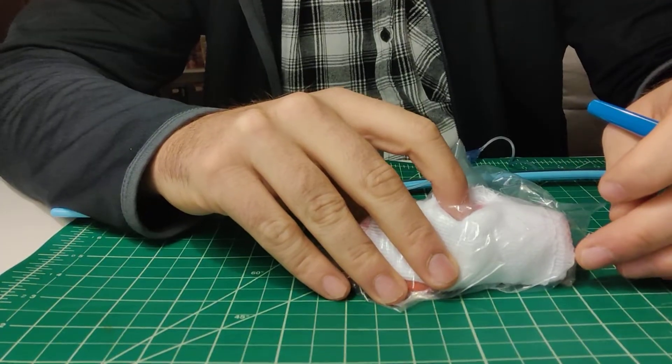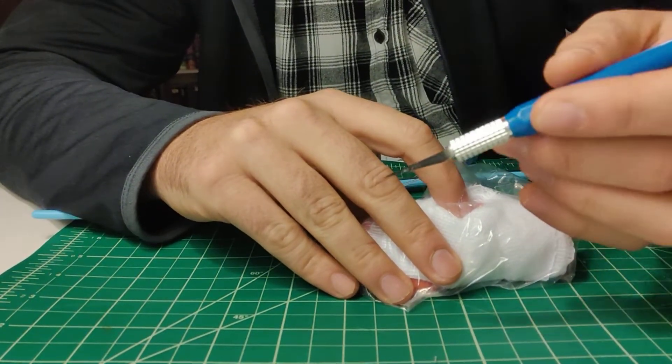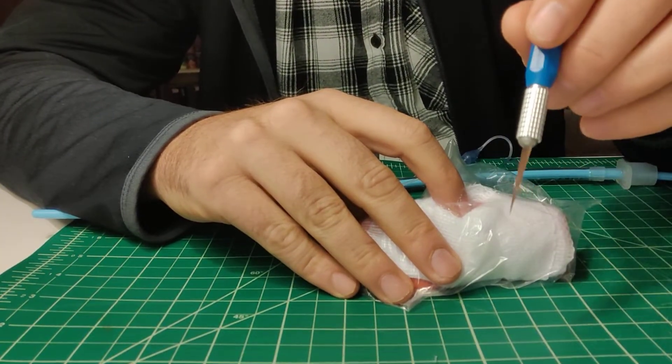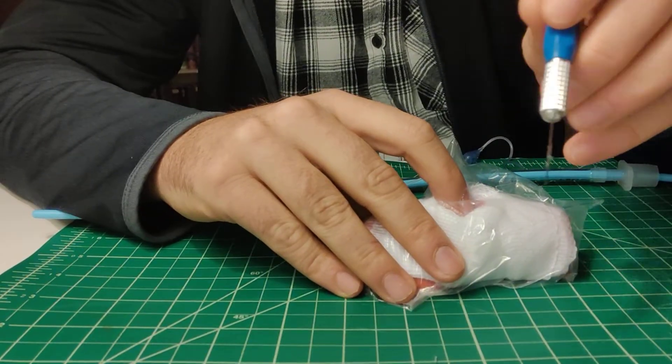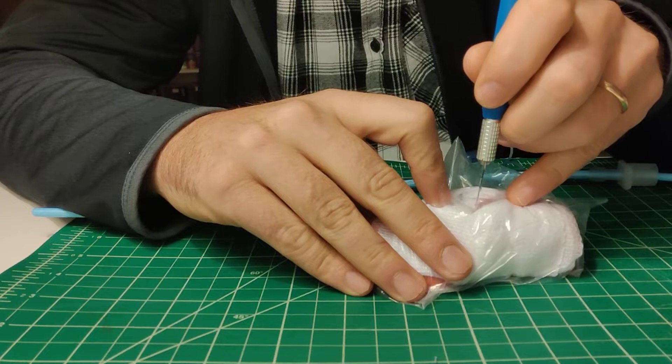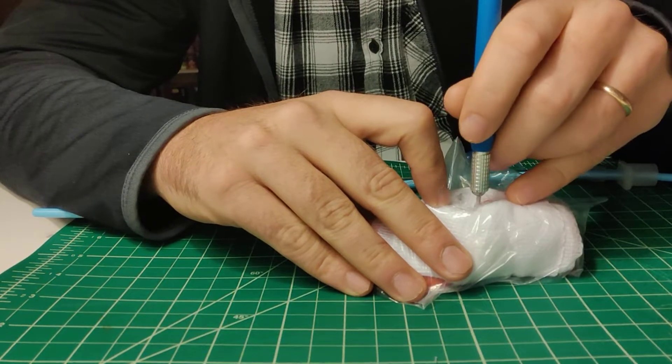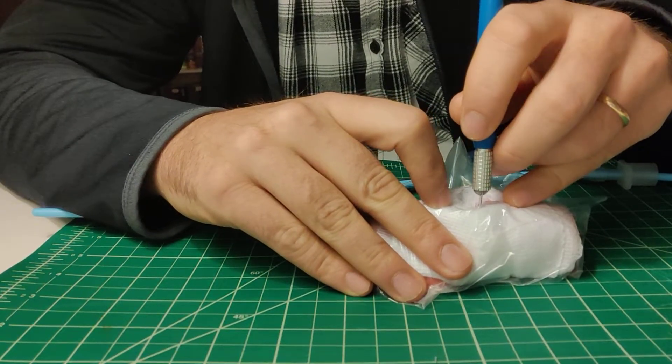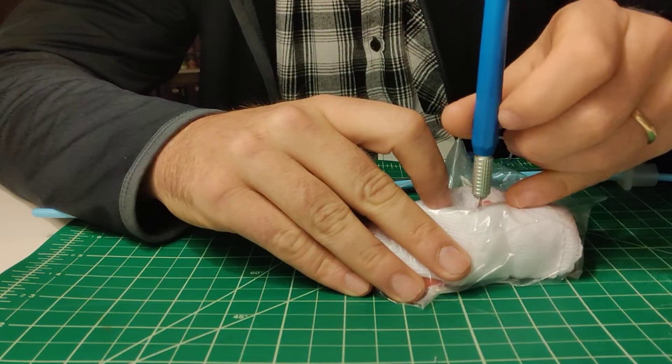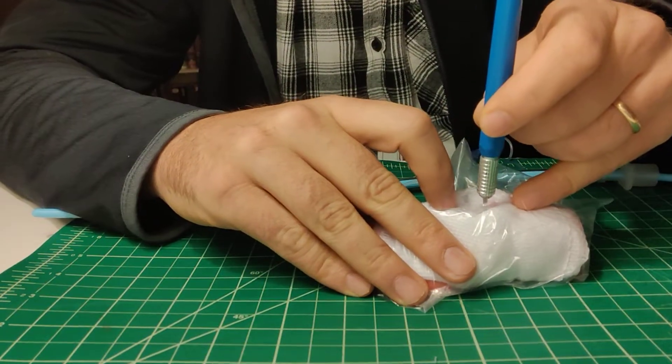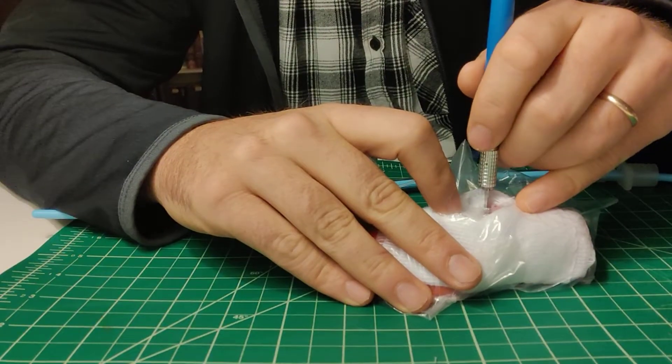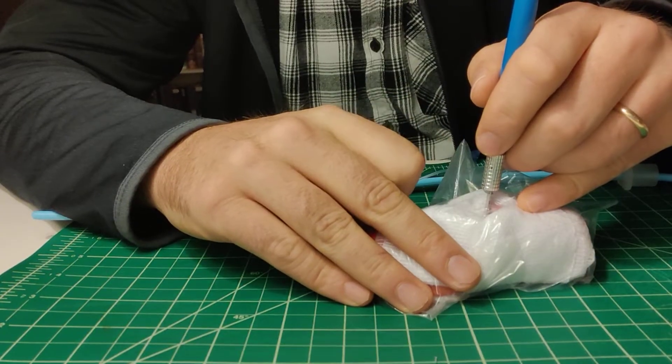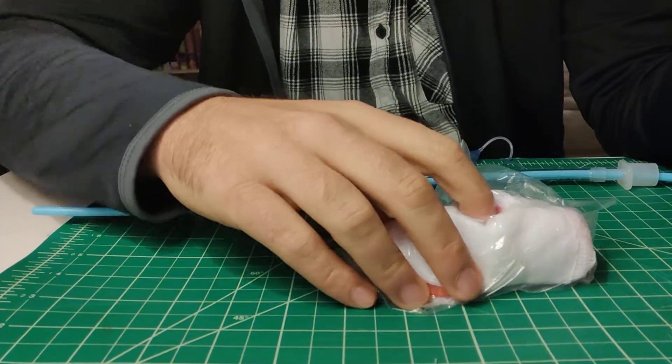Okay. Once you feel like you're pretty good and you're on top of the cricothyroid, then your first incision was vertical. Your next incision is going to be horizontal. So you start with the blade turned away from you with the sharp point turn away from you go perpendicular to the cricothyroid. You go all the way in puncture, and then hit the posterior wall of the trachea. When you do that, then you move the blade as far away from you as it can until it hits the lateral wall of the trachea. Then you flip the blade 180 degrees until it's coming towards you. And then you bring the blade all the way towards you. So that makes a horizontal incision all the way through the cricothyroid. Notice my finger is not in there messing around while it's doing that. The blade comes out and then your finger goes in.